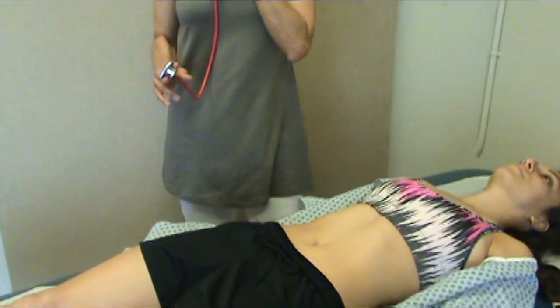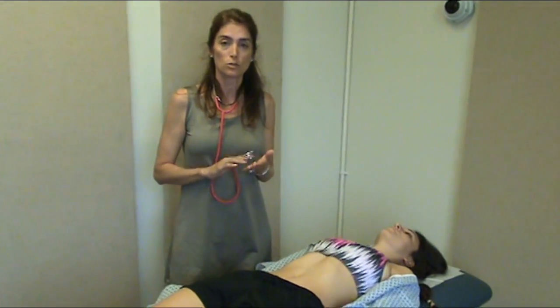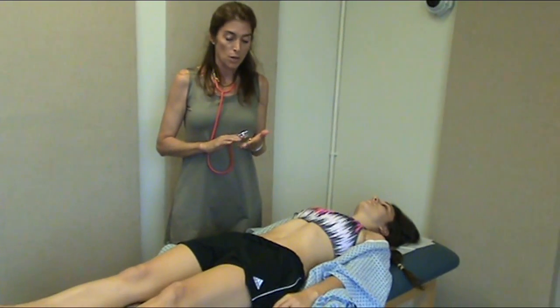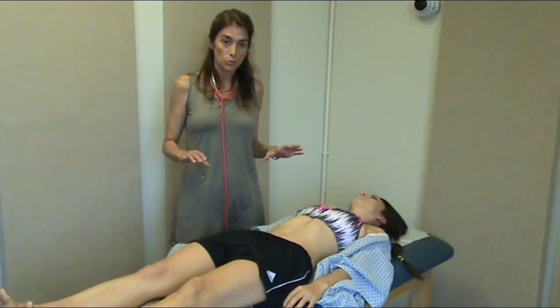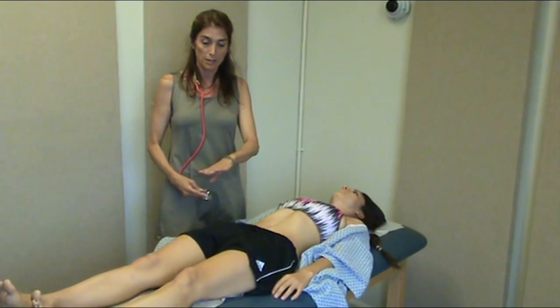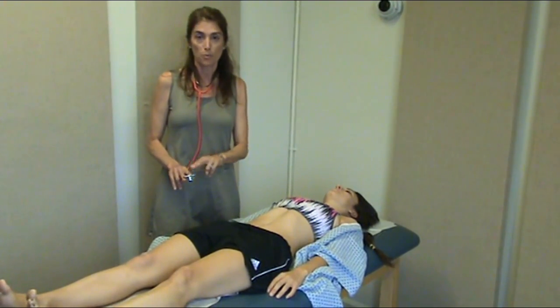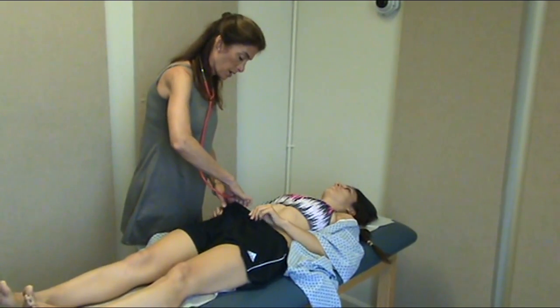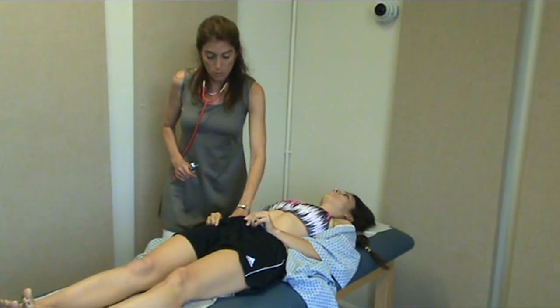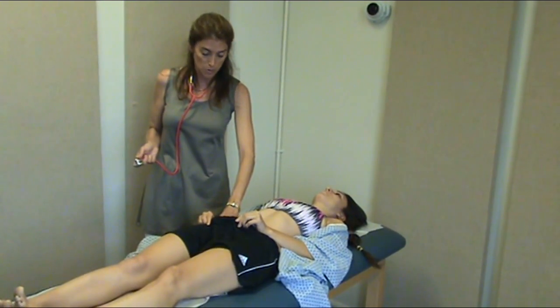Then you're going to move down to palpate the femoral artery and to auscultate for a bruit of the femoral artery. It's real important here that you get your patient to assist you in raising the waistband so that you can palpate and then move your stethoscope onto where your fingers are palpating the artery properly. So if I can get you to lift up, and then you want to explain to your patient what you're doing, that you're going to be palpating for a femoral artery.